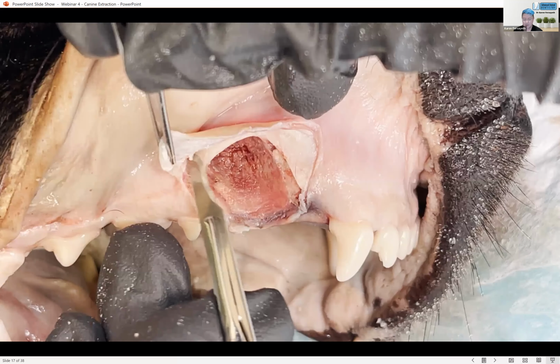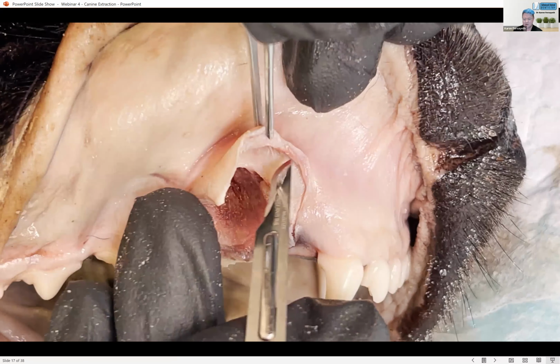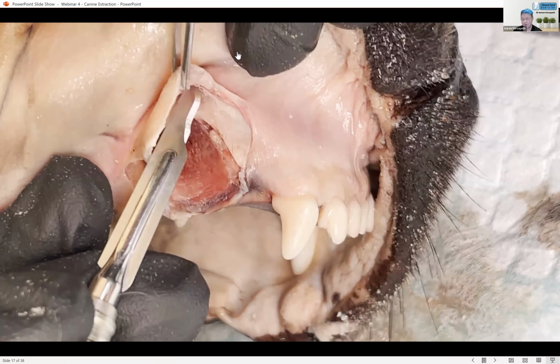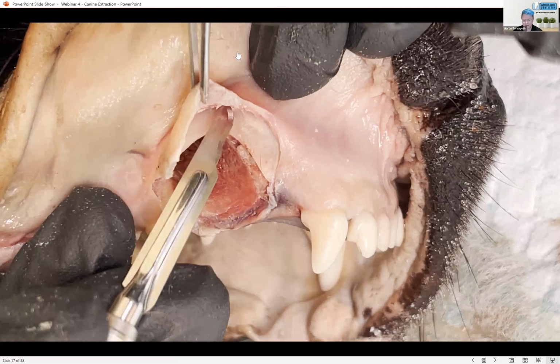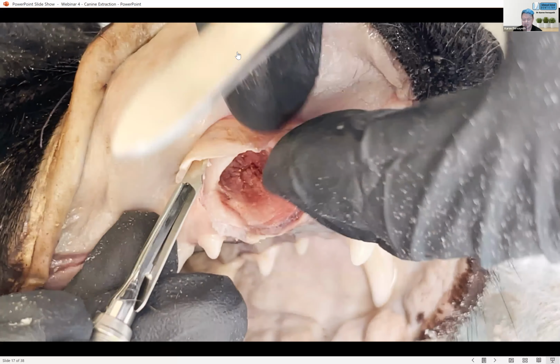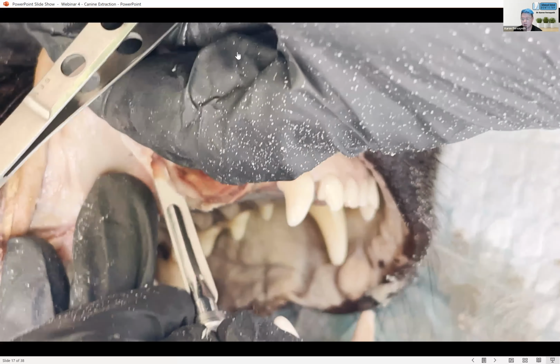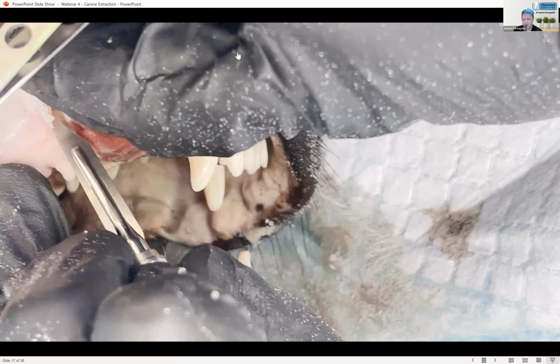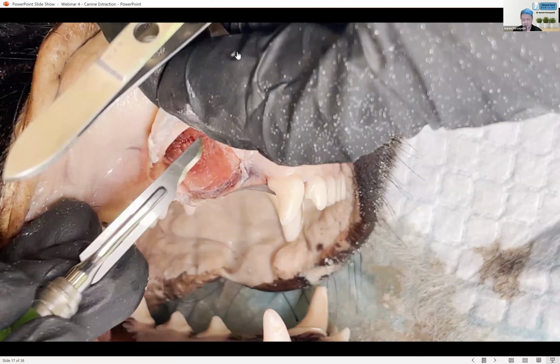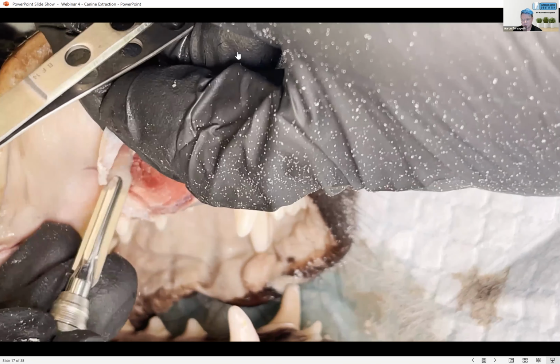This will come up in tips and tricks. It's not even a tip. This is key to successful closure of the mucoperiosteal flap. It's mucosal plus, in brackets, gingiva and periosteum. Periosteum is inelastic. We have purposefully lifted it up. We want that tissue, but it's inelastic. So if we go to close this flap, I'll also make some excuses here for this video. This is tricky, and you need to be quite specific with what you're doing.